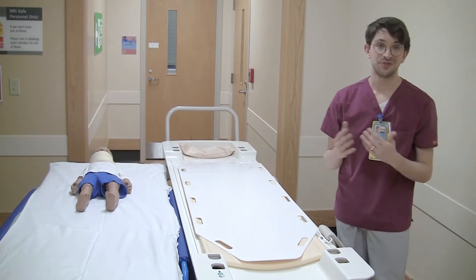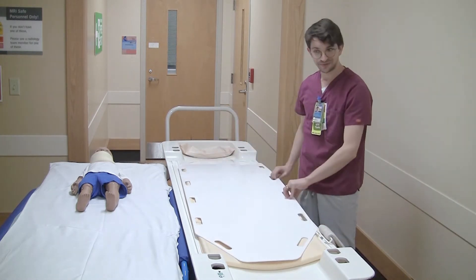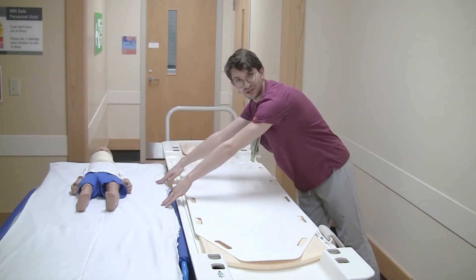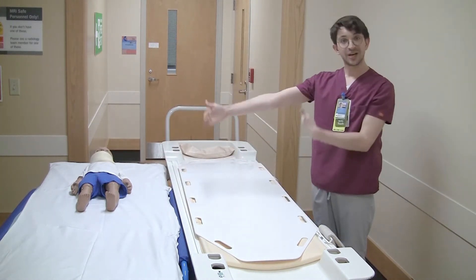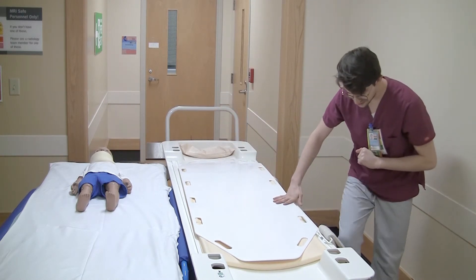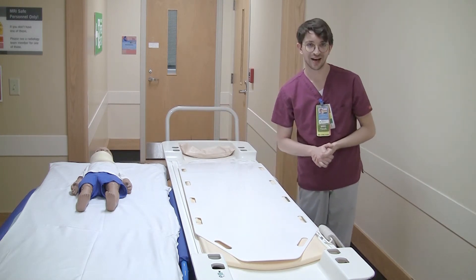Before we are able to do this we have to have a few things prepared first. We need a slider board, we need a sheet under the patient on the bed that they are currently on, we need the beds to be aligned with each other, and don't forget to lock the brakes. Finally, we need enough people to handle the weight of the patient.